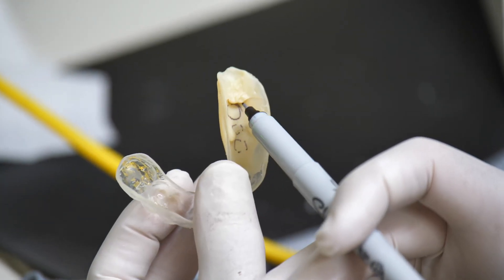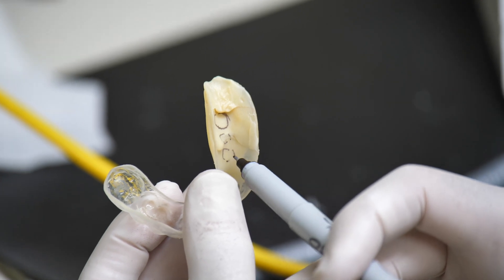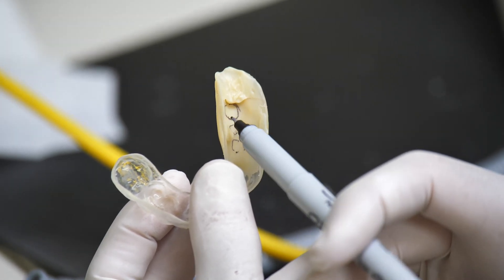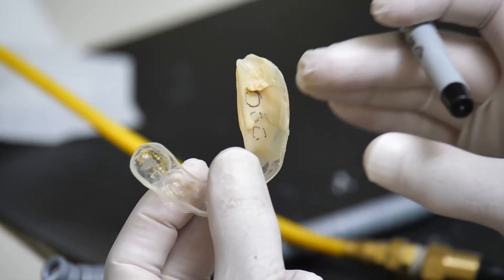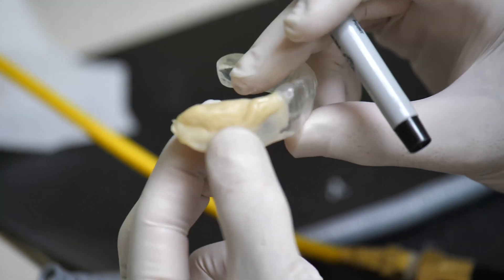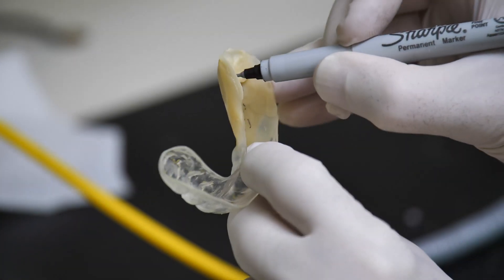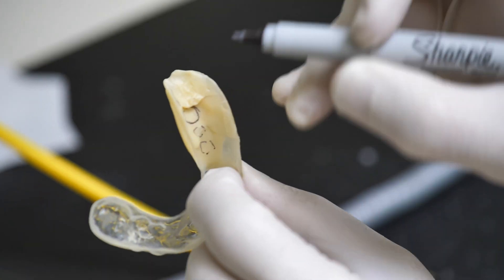These are the approximate positions of the implants we just placed. We don't want anything to touch these implants even when he's chewing. This may press down, so we have to make sure that there is some support on the ridge in this area, and we have to grind away at least two millimeters of this to provide relief over the implants.